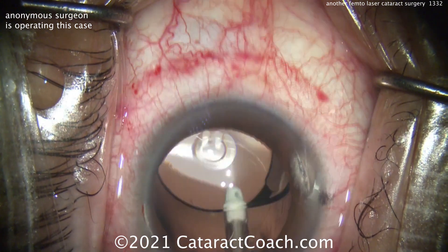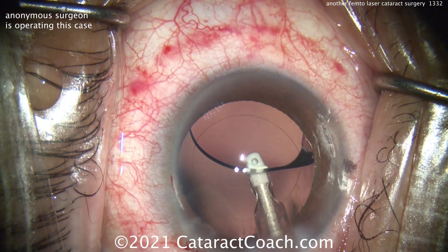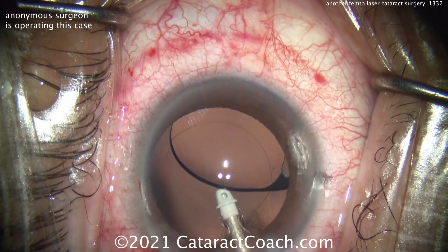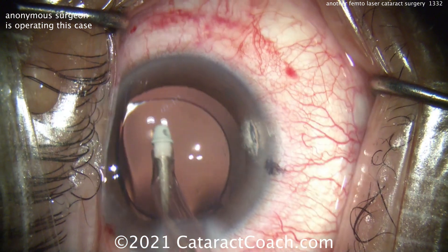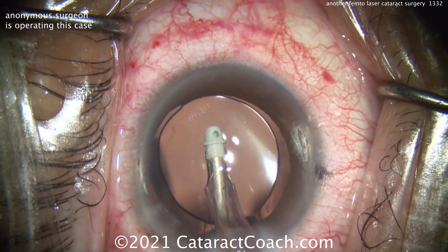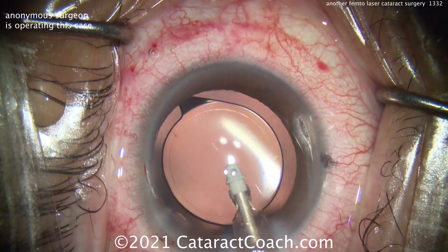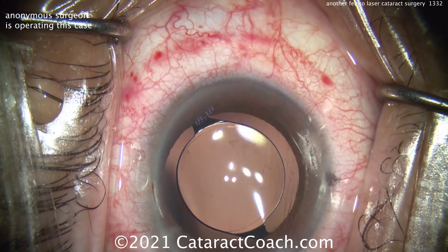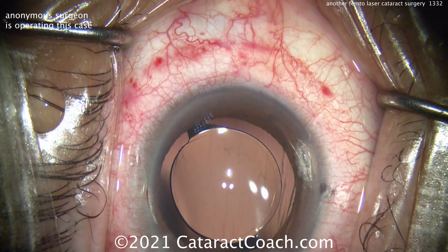Looks like a nice case here, taking out all the viscoelastic. The laser is a neat toy, and in this case what's different is the surgeon decides not to use the laser to make the incisions — and that I completely understand. Because I think where we are today in our typical cataract surgeries, you're better off using a steel keratome or even better a diamond keratome to make your incision. It's going to be a lot cleaner and oftentimes more predictable in terms of placement and ability to seal. I know a lot of surgeons are not using the femtosecond laser to make their incisions, even if they use it for the capsulotomy, astigmatic treatment, or to divide and soften the nucleus. But they won't use it for the main incision — and I kind of agree with this surgeon that using a steel keratome will give you a nicer result.